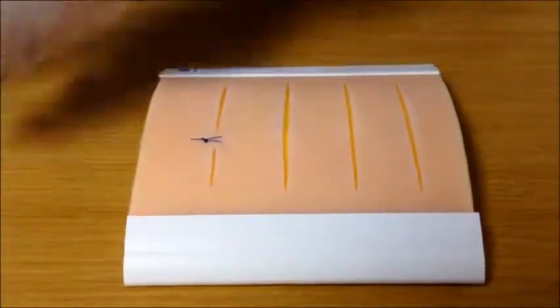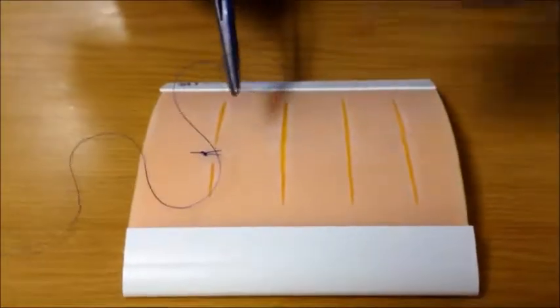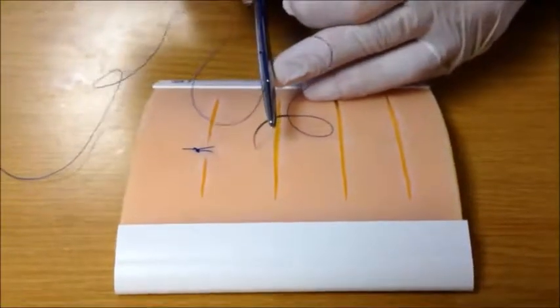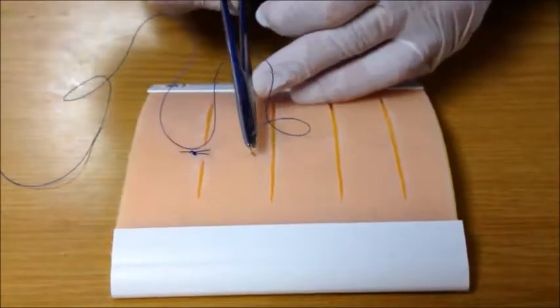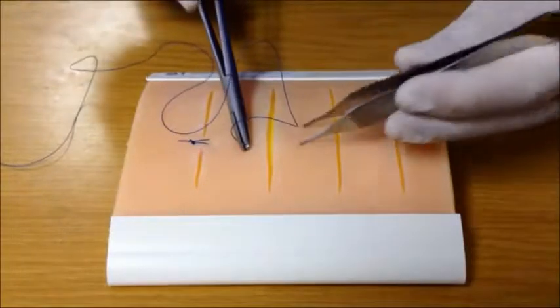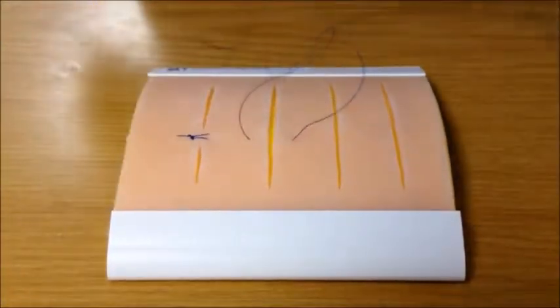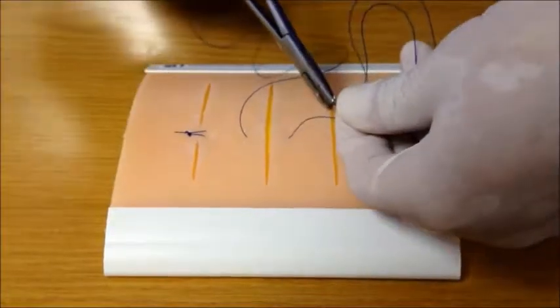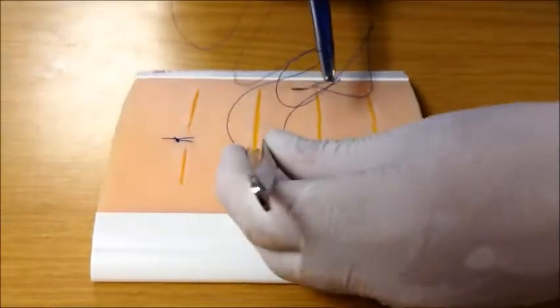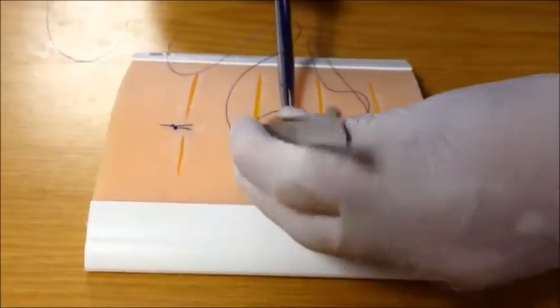Another useful suture to use is a vertical mattress suture. A vertical mattress suture takes a bite of tissue that is slightly further and deeper than a simple interrupted suture initially, as an initial throw. Reverse the direction of the needle on your instrument so that you can come back across the wound. To come back across the wound, go shallow and close to the wound edge, grabbing only a small piece of skin.